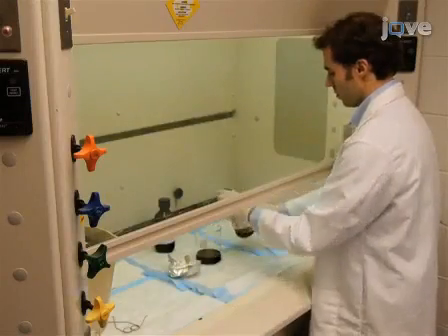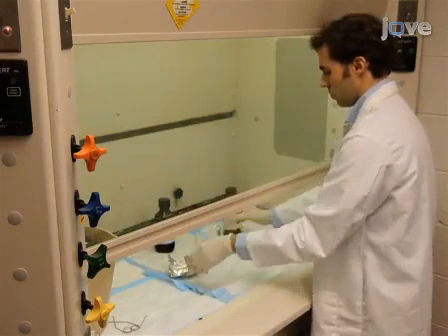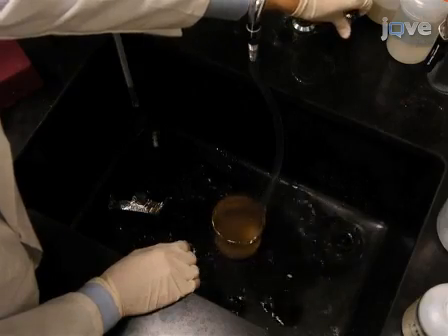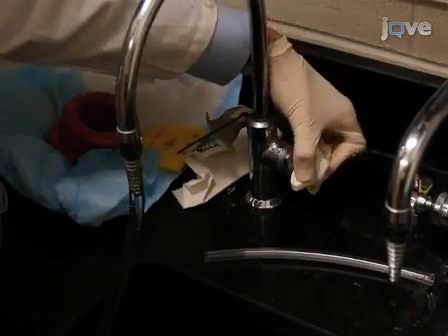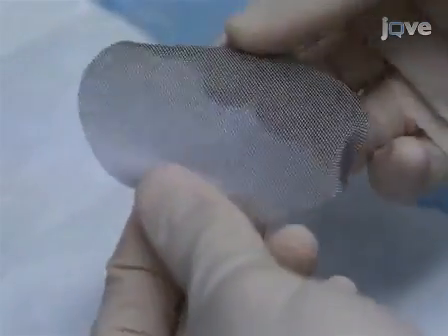First, pour chromic sulfuric acid into a glass beaker and immerse the metal raft grids in the acid for one hour. Then continuously rinse the grids overnight with tap water. After the overnight rinse, rinse the grids for another three to five hours in double distilled water, then let the raft grids dry.